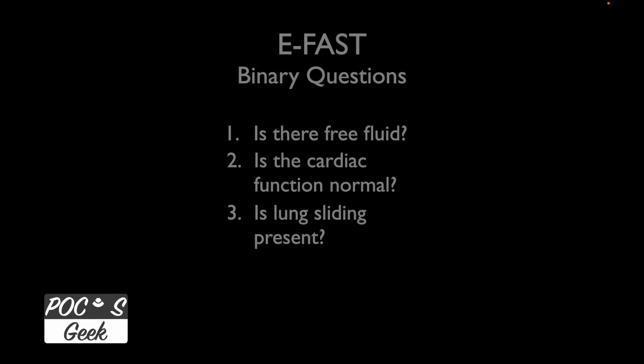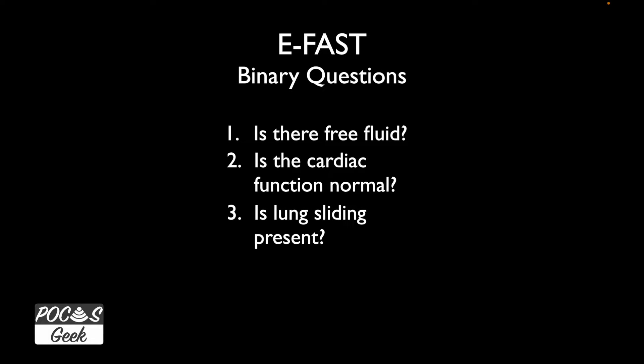I want you to approach this as you look at the images addressing these binary questions. When it comes to 'is there free fluid,' we're going to think of that in the intraperitoneal or abdominal cavity, in the thoracic cavity, and also in the pericardial sac. I'm going to give you a chance to look through these images and formulate for yourself the answers to these three questions and see if you can identify all the pathology.